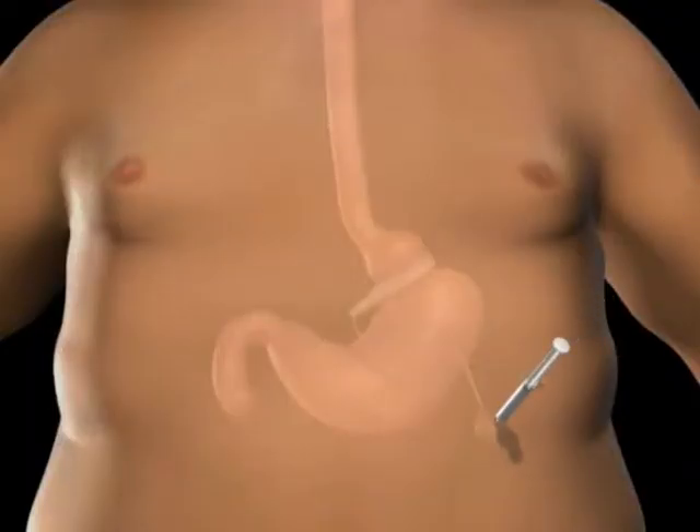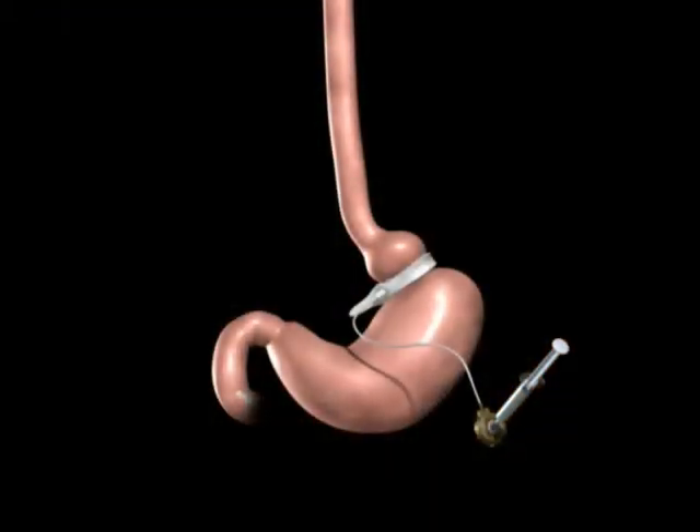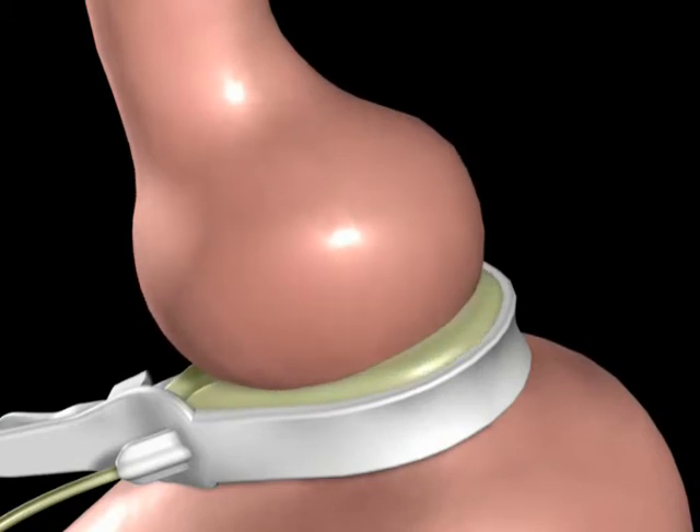Your surgeon may tighten the Realize Band by injecting saline into the injection port. As the saline is introduced to the Realize injection port, it travels through the tube to the band. The addition of saline to the band creates a smaller upper stomach pouch.